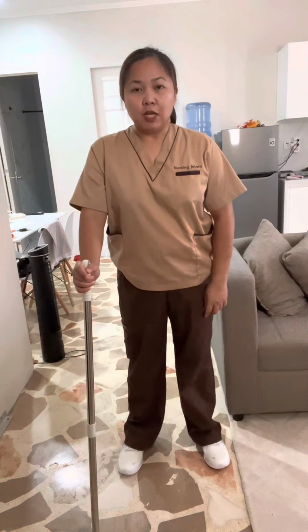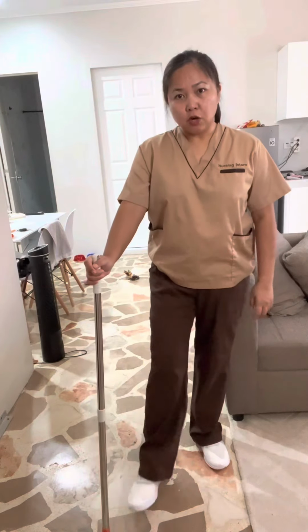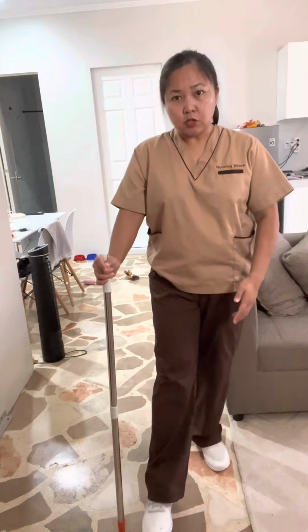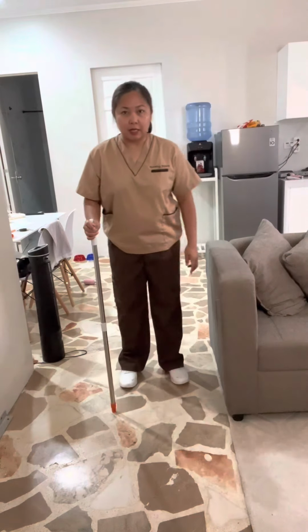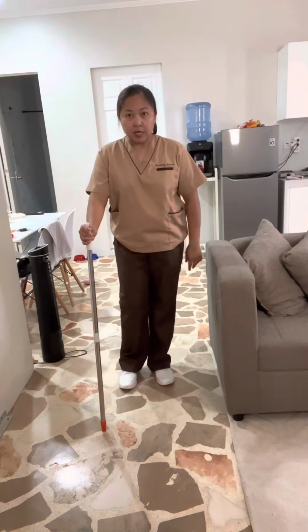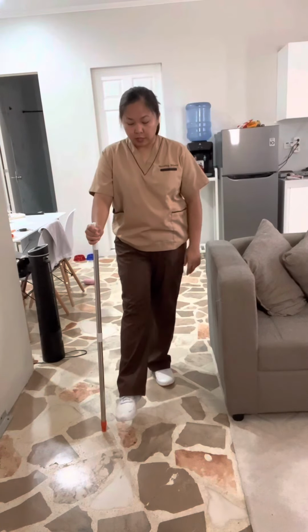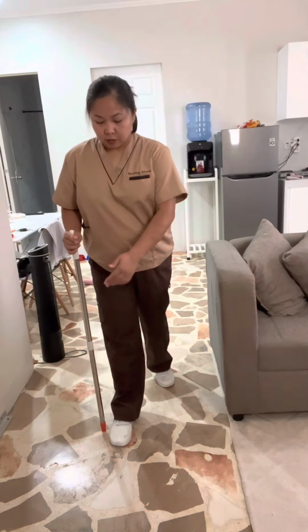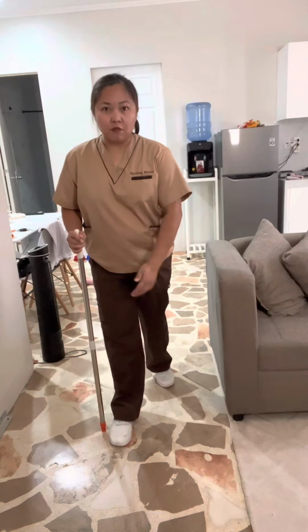Then you follow through with your stronger leg a little bit over the cane. So let's pretend I've already advanced this about 4 or 5 inches forward, and my right leg, which is the stronger leg, will be a little bit over the distance of my cane.